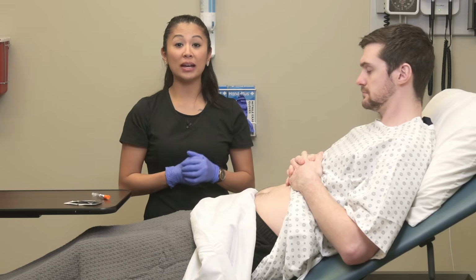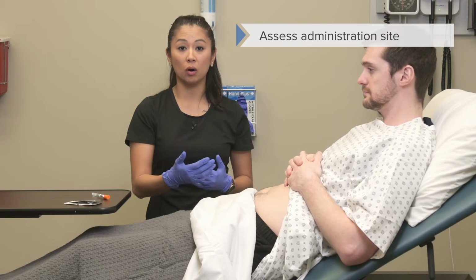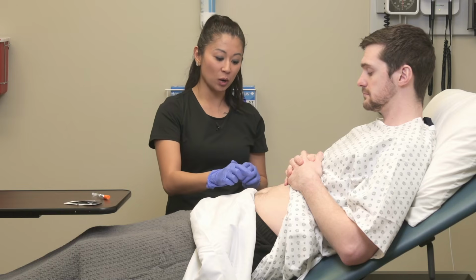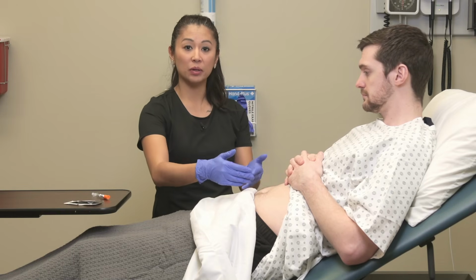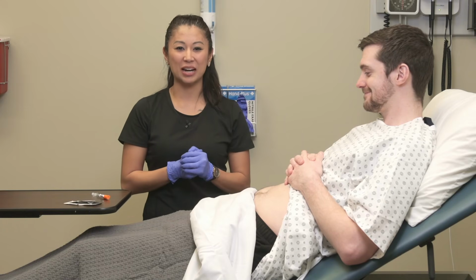So before I give the injection, I want to assess the site, make sure there's no wounds or scars on the place that I'm going to inject. Typically, we want to go at least about an inch out from the belly button, and anywhere here on the abdomen, we can go all the way to the love handles, if you will, on the side of the stomach.